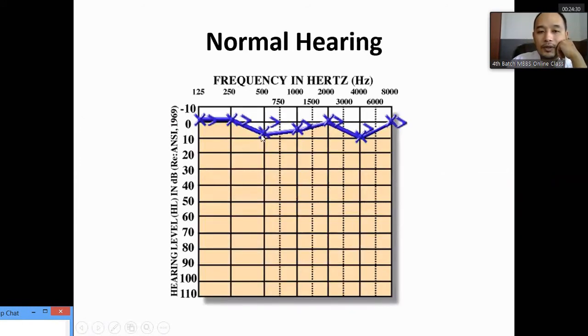Now just see, this is the audiogram graph, the hearing test taken of the left ear. Everything is in blue, cross, and this greater than sign is plotted against the different frequencies. Here at 125 hertz, it's 0 decibel. The patient can hear the sound at 0 decibel.